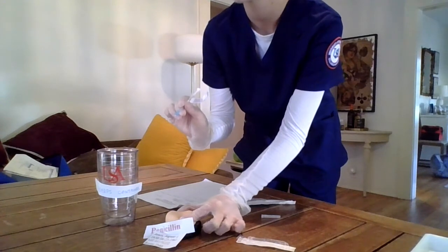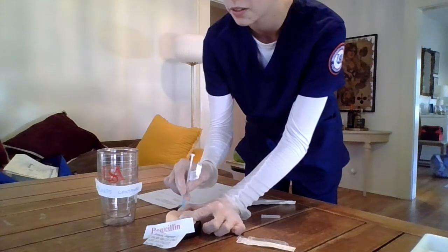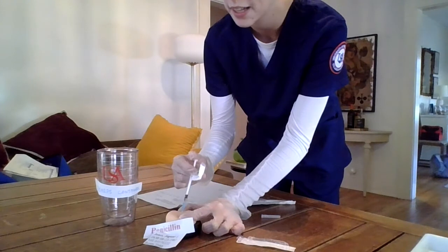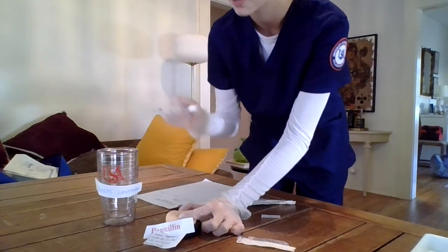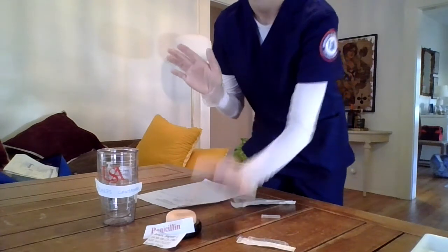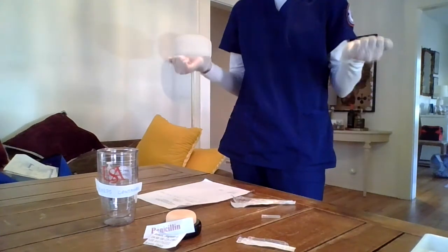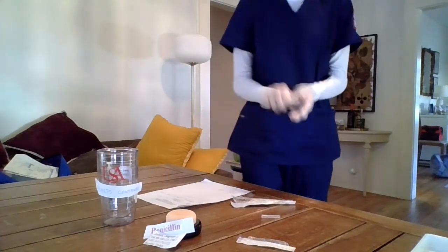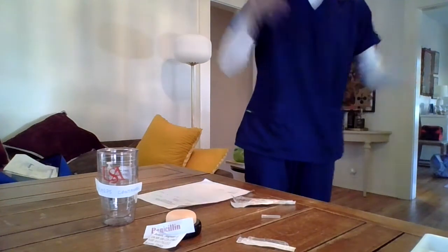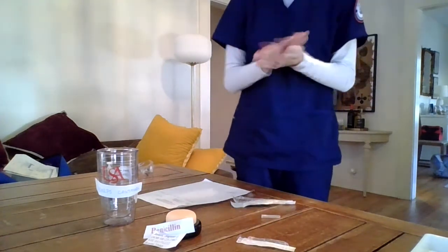So, okay, Mr. Jones, you're going to feel a small stick. So I'm inserting at a 45 to 90 degree angle, and slowly inserting my medication. Okay, and then I will dispose of it properly into my sharps container. So then I will assist my patient back to a comfortable position and raise my side rails. I am then good to remove my gloves and my goggles, and we'll need to perform additional hand hygiene.